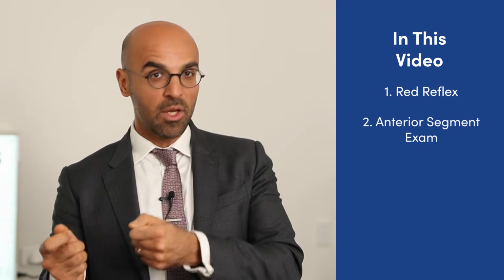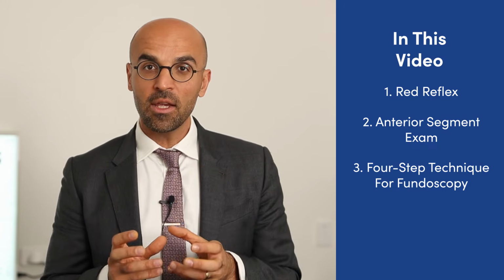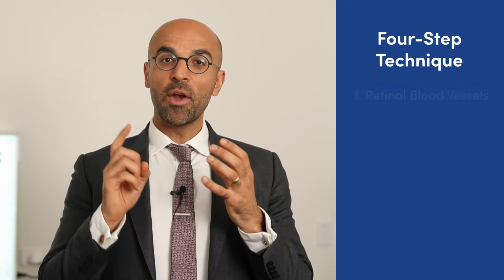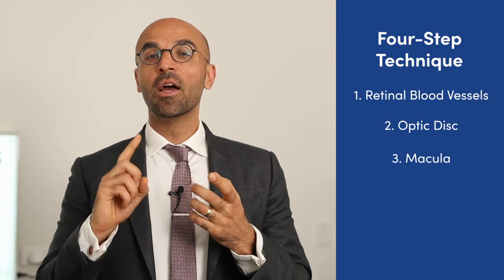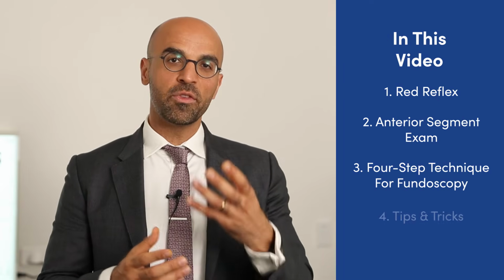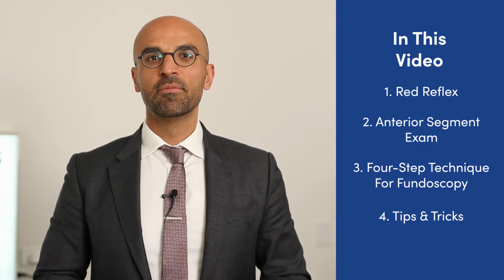In this video, we'll cover the red reflex and the anterior segment exam before moving on to the 4-step technique for fundoscopy, which consists of assessing the retinal blood vessels, the optic disc, the macula, and the retinal periphery. As usual, we'll wrap up with some tips and tricks at the end, so let's begin.